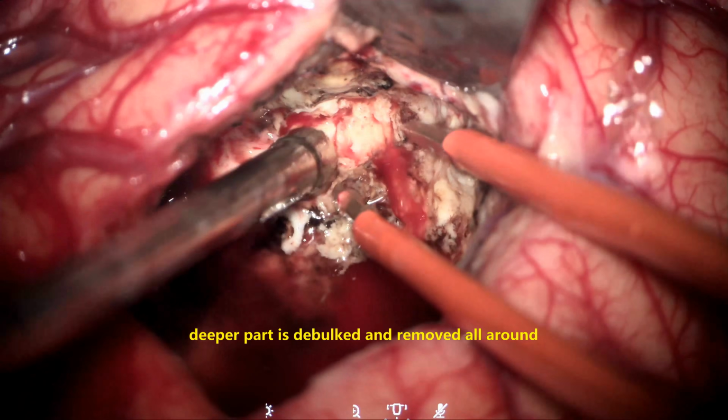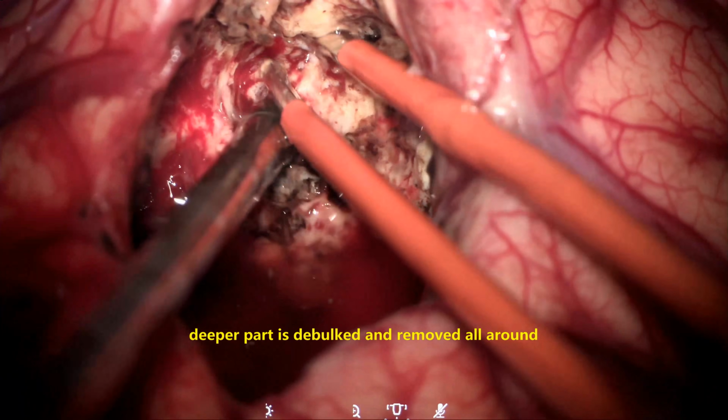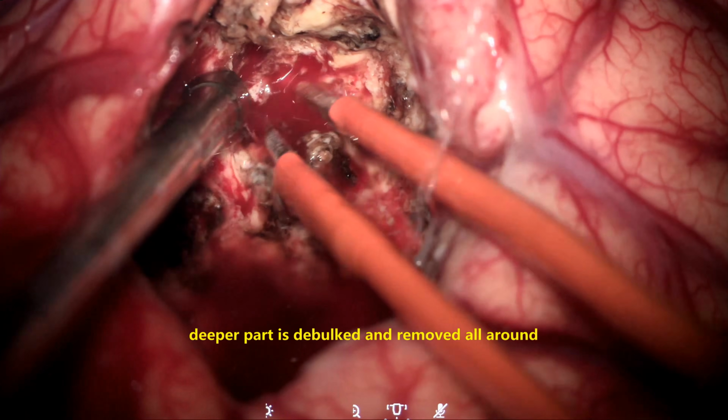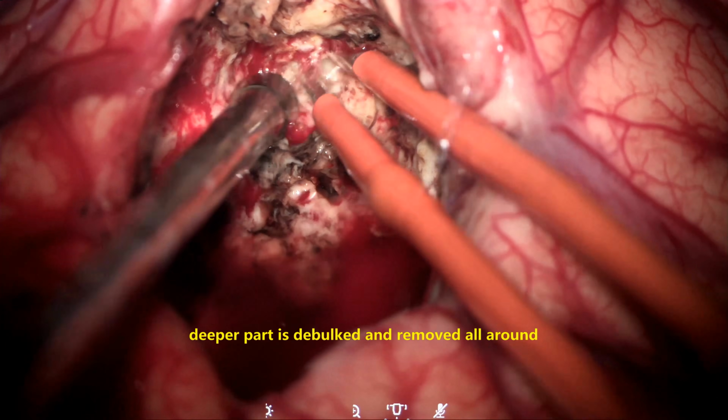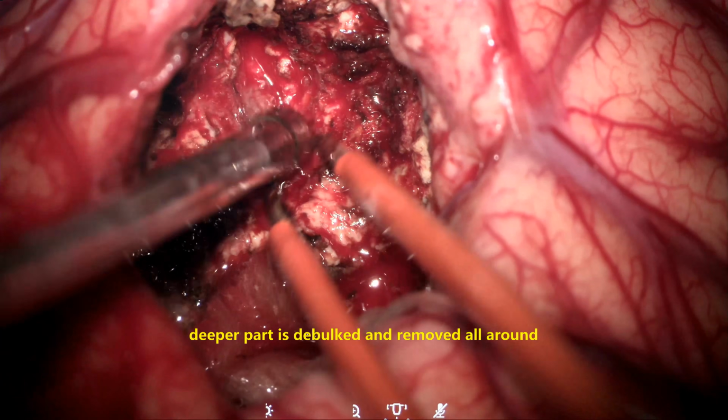In the deeper parts of the tumor, the glioma, there is some amount of ooze from the deeper vessels, coming probably from the insular branches of the middle cerebral artery. They are coagulated patiently, and complete blocking or hemostasis is achieved, as shown here.